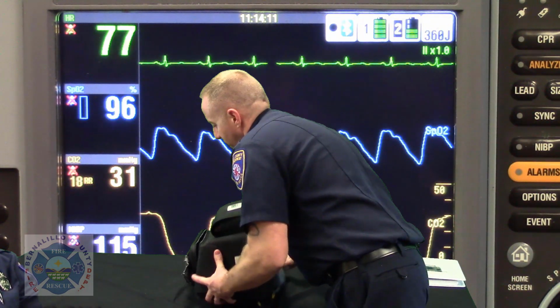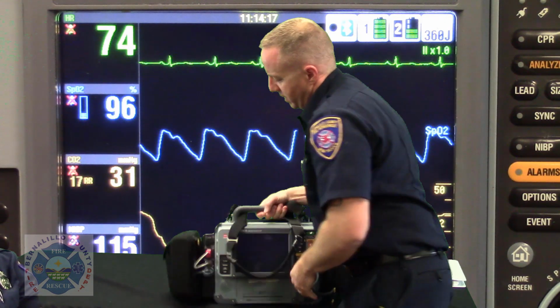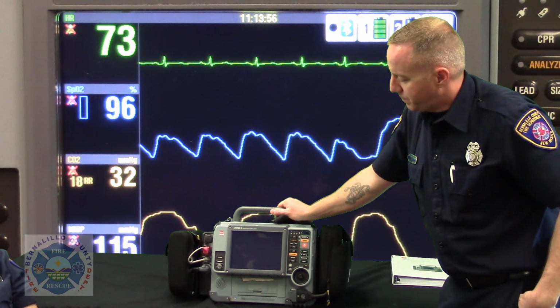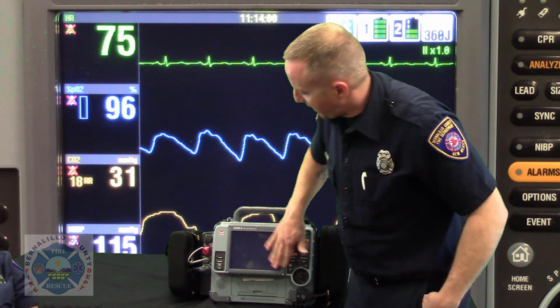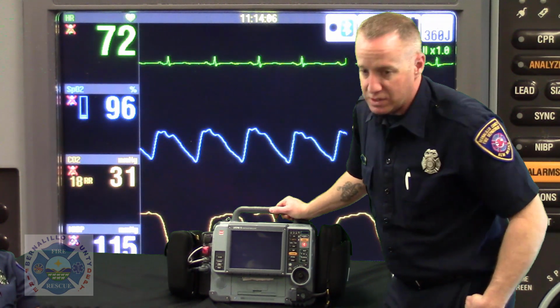I've actually seen it barely hanging on upside down because of turns and all whatnot during just normal vehicle use. And this is a $33,000 piece of equipment, and we really would like it to be functional for everybody. So, if I were you, I would treat it as a $33,000 piece of equipment. That way we can use these well into the future.